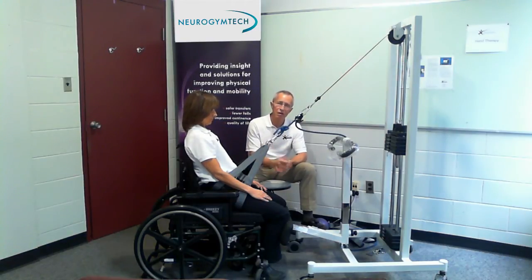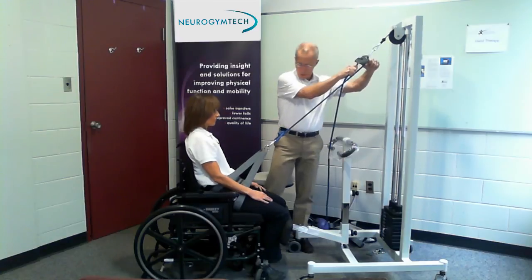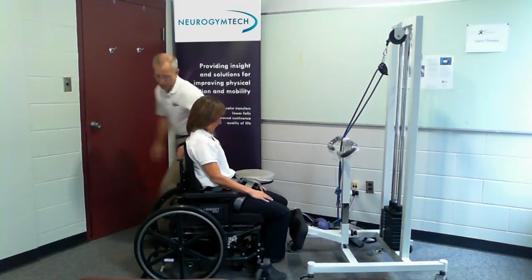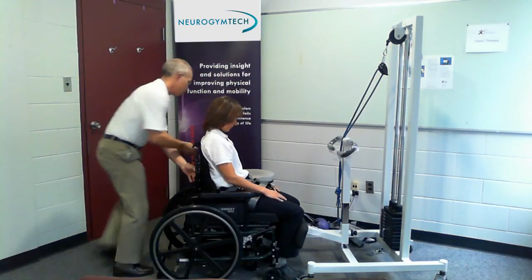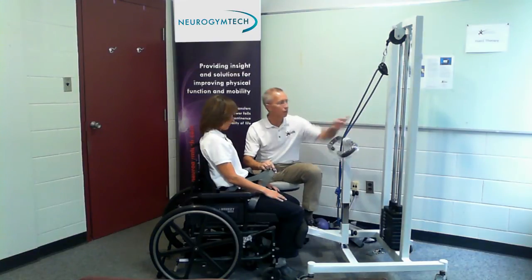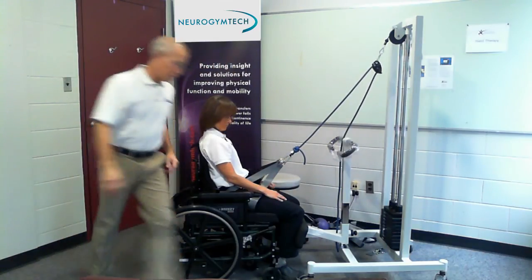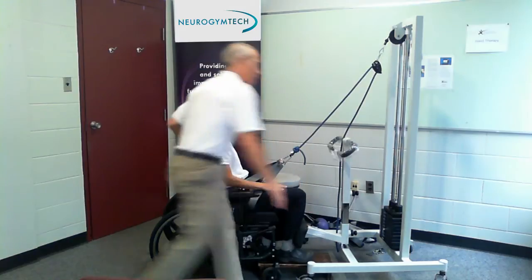Now's a good time to stop the video and swap in a new patient and new clinician for application number two — a hemiplegic patient. This person is left-side-affected hemiplegic. I'm going to bring the pad in here and bring her right up against the pad, remembering to lock the brakes. I'm going to engage a little more weights than normal because we're going to do a one-legged squat on her affected side. She is left-side affected, so I'm going to take a stool and put it under her right foot to take her right leg out of the equation.